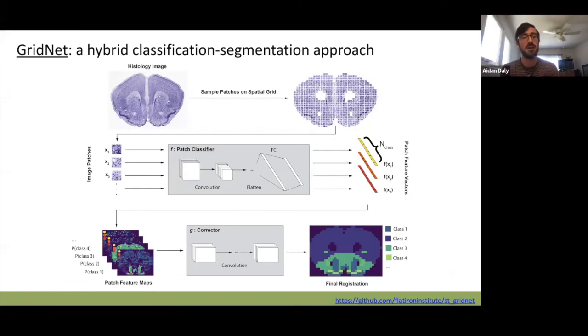I am definitely thinking that in the future, particularly in cases where you don't have these clear visual hallmarks like you would have in the brain or the spinal cord, say you're looking at a tumor biopsy, the H&E image alone might not be enough to give a reliable segmentation. So you might want to definitely look at both.